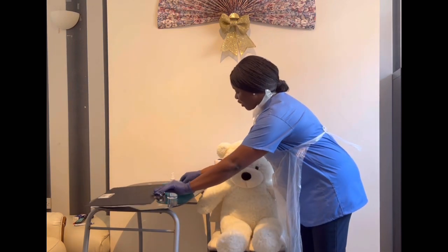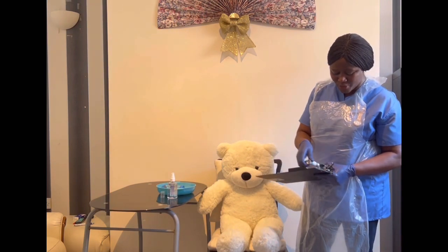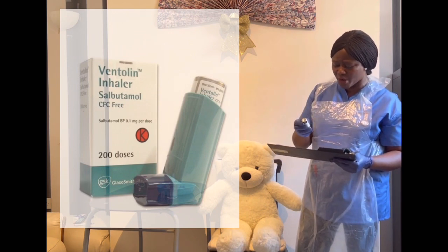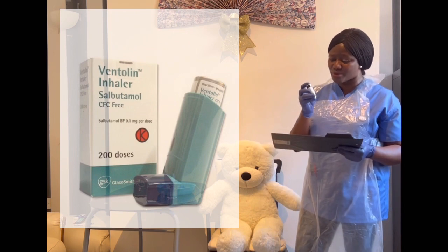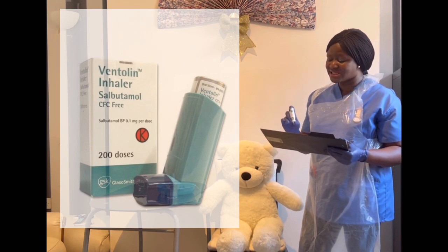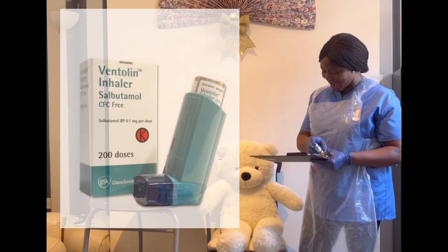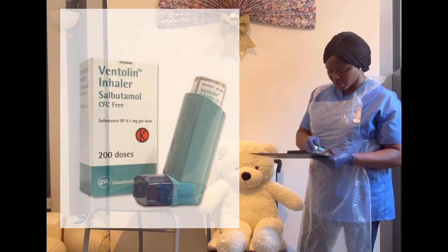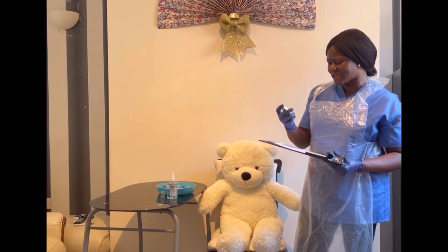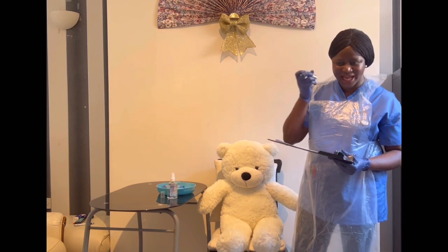Of course, part of the things we also have to check: I have to confirm this is the right medication. It's a salbutamol inhaler. So I'm sure I've gotten the right drug, the right dose, the right route, and it's to be given at the 10th hour, the right time. So I'm happy to go ahead with this medication. Okay, this Ventolin inhaler is in date, not expired. Expiry date is November 2025. So I'm happy to use it, and it's not empty.